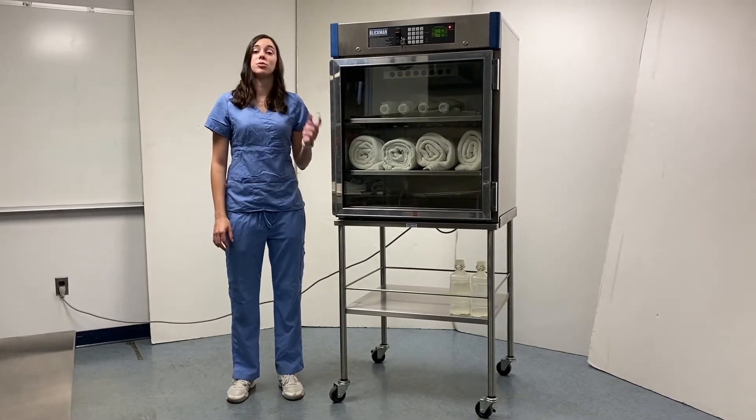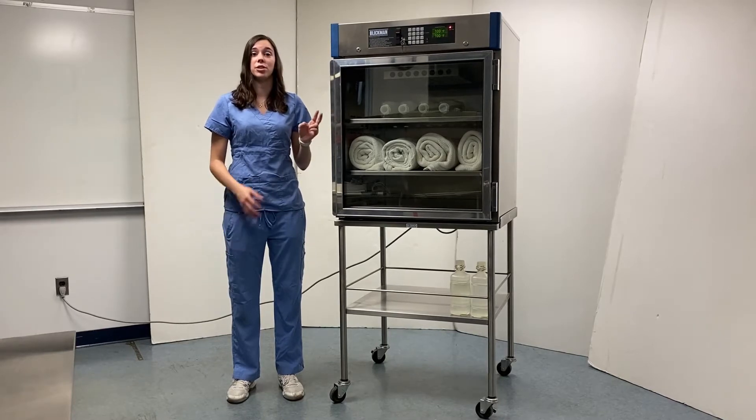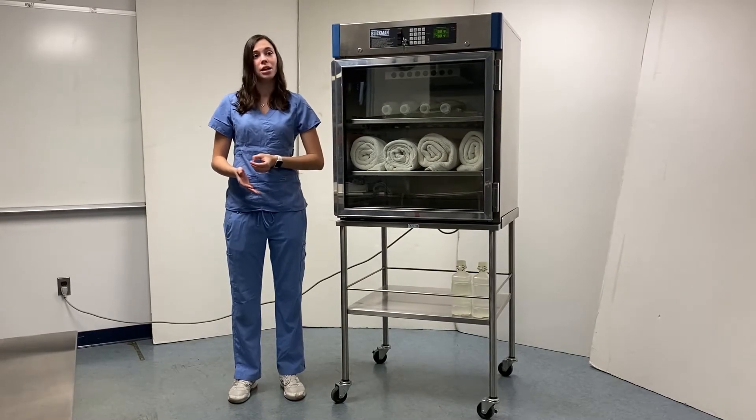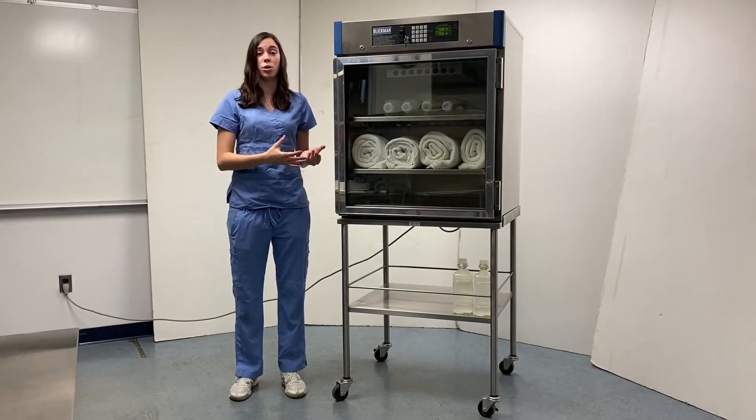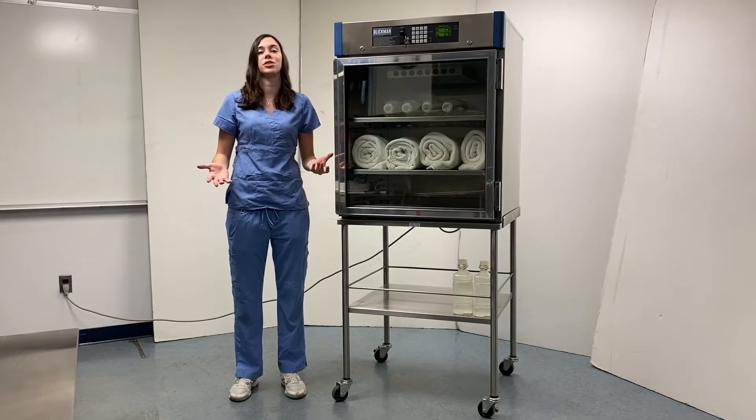This model comes standard with two perforated shelves to allow for better heat circulation in the warming cabinet. Additionally, the fan is placed up top to improve storage space within the warming cabinet and again improve heat circulation throughout.